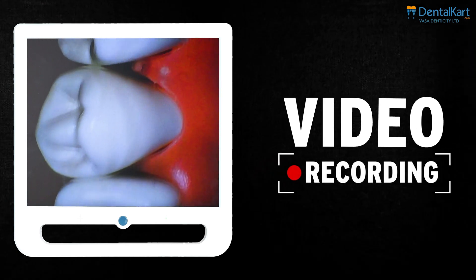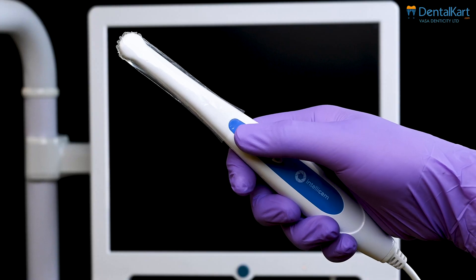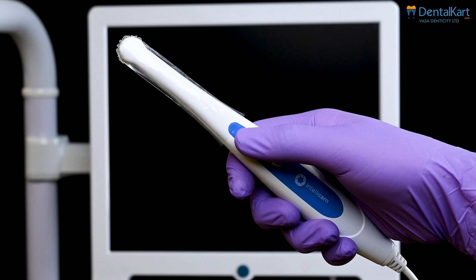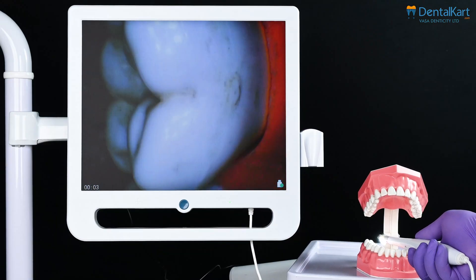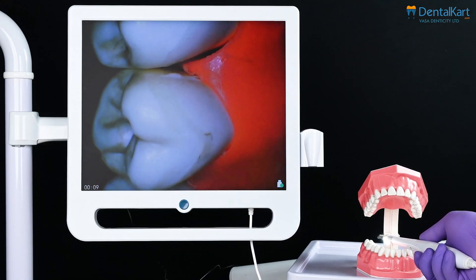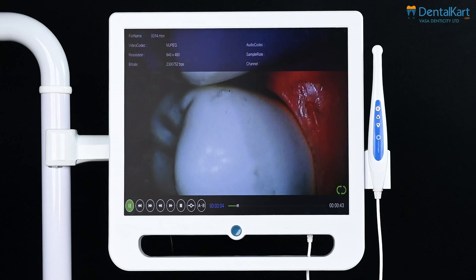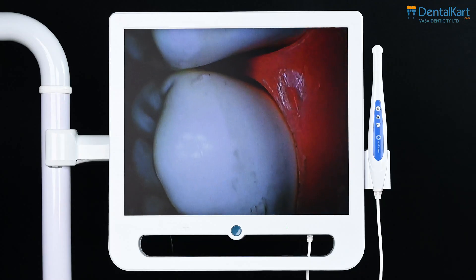Let's see the video recording function. Press the button to enter single picture mode, then press and hold the button for three seconds to enter recording mode. The lower left corner of the display shows the duration of the recording. Press any key to exit the recording and the video will be automatically saved.